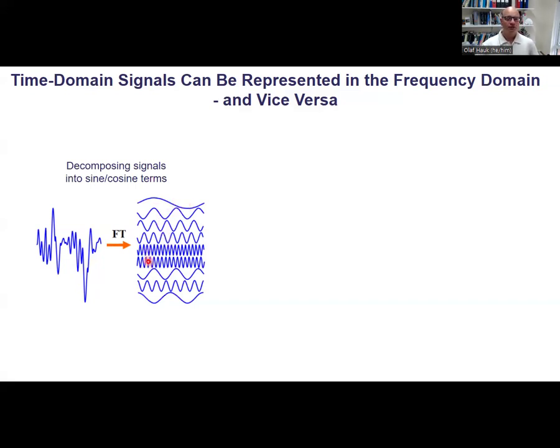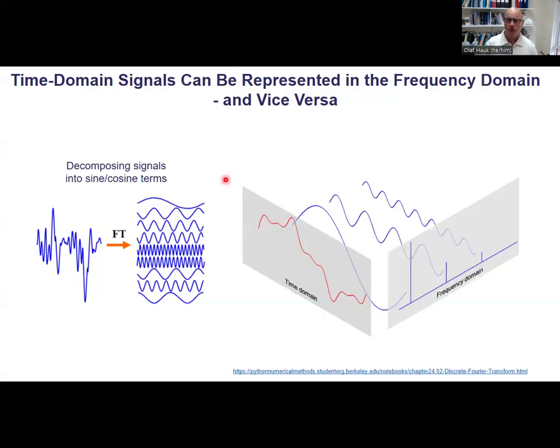And here every frequency is represented twice, because in the frequency domain we also have to deal with the phase of the signal. Every frequency can be shifted a little bit backwards or forwards in time, and that would be represented as a phase in the frequency domain. So every frequency is represented twice in the spectrum in theory. So this is also represented here.